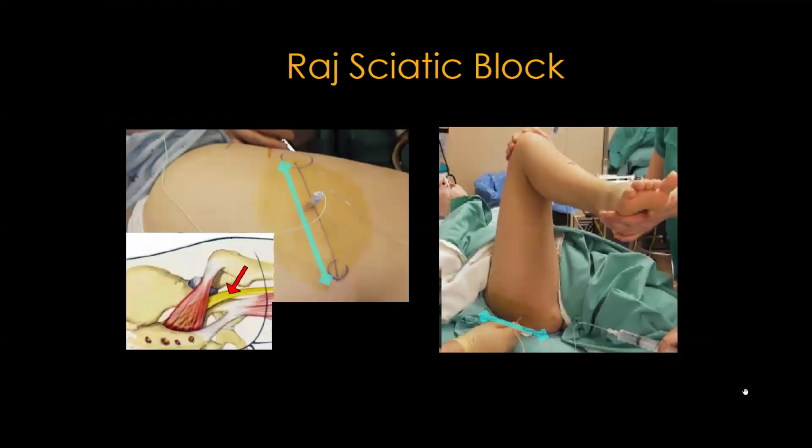All right, your approach to the sciatic nerve. So I'm doing an AKA. This is my go-to, as long as they don't have a very big rear end. If they have big gluteus maximus, minimus, it's going to be hard to see. But most patients that come for AKA are not real heavy on those. And this is for an AKA block, that's where I'm using this.